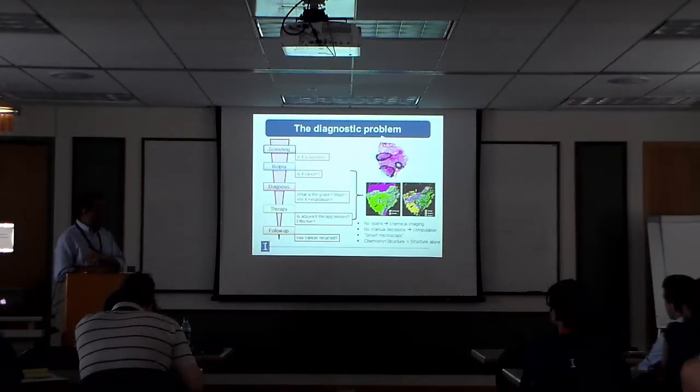So on the image in the right, you see all the pink stuff is gone. We're only left with the green pixels, and then we analyze the green pixels further and just leave them green if we're sure that they are normal. If we're not sure that they're normal, then we color them something else, right? In this particular case, we've colored them with grade 3, grade 4 cancer in the prostate. There is no other cancer in this.